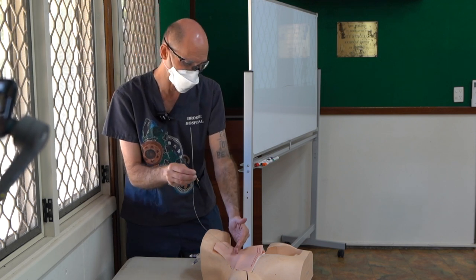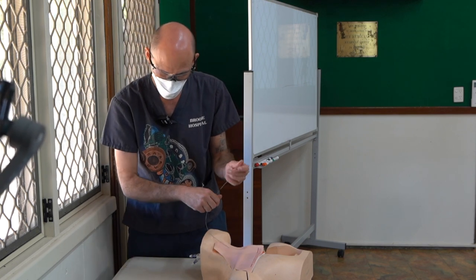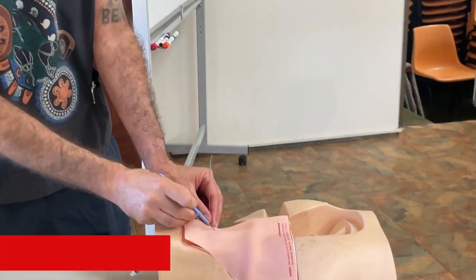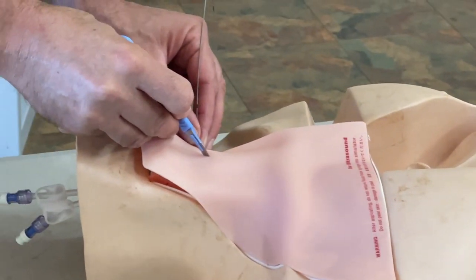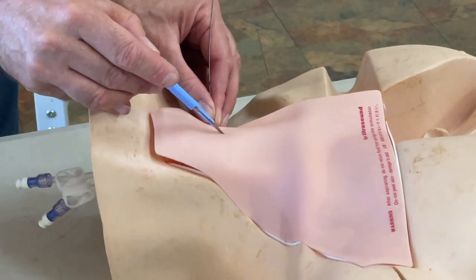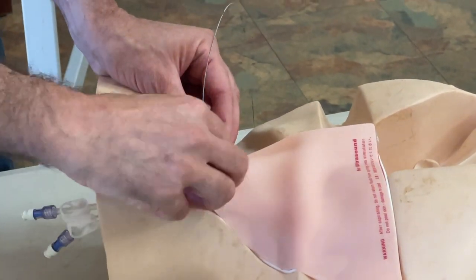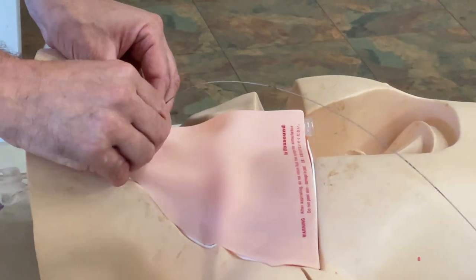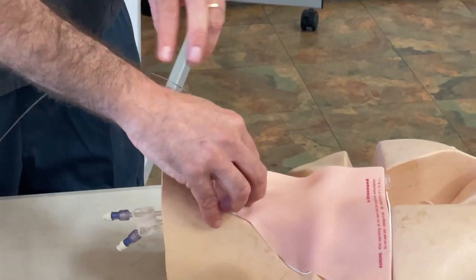So I now know I'm definitely inside the IJ. What do I do next? The skin's there — scalpel has two sides. The blunt side of the scalpel goes on the wire, not the sharp. Push through the skin — it feels like I pushed through. Some people do just a tiny little nick, but that's not probably enough. You actually go through the whole skin layer and come out, then get your wire and rotate it around a bit to make sure you can move it freely, because that's the next problem you're going to have. Make sure you can move that wire around — it's the same trick you use in other procedures.